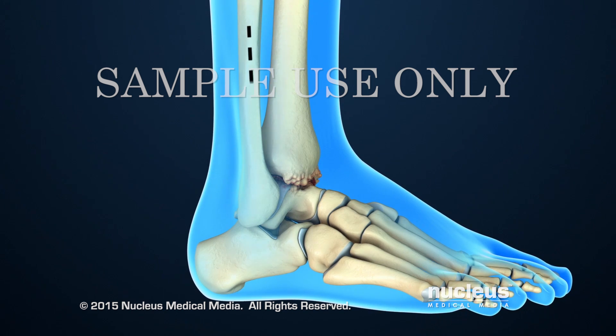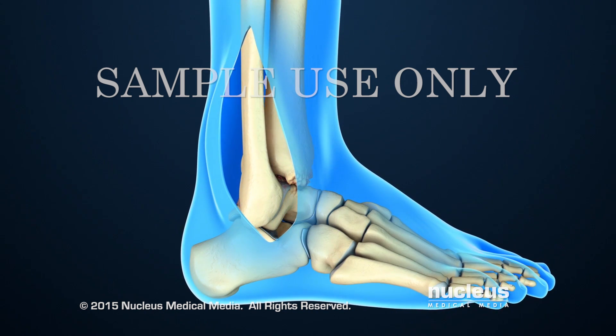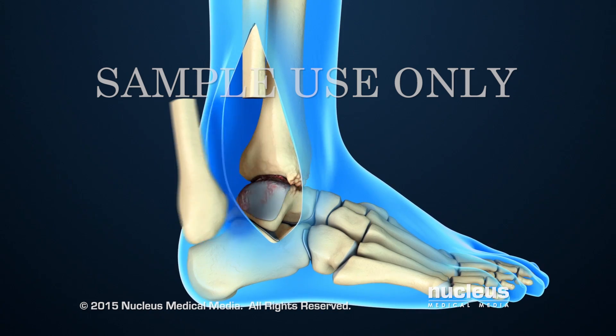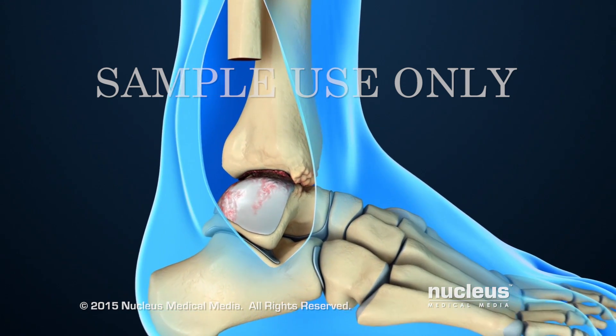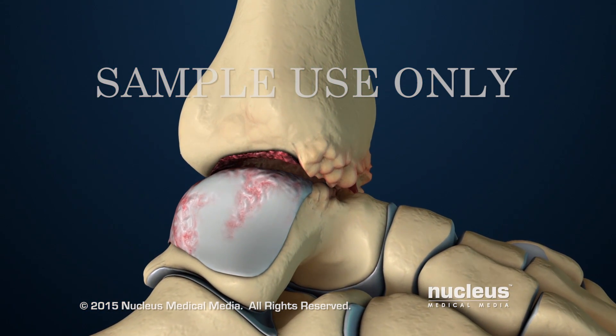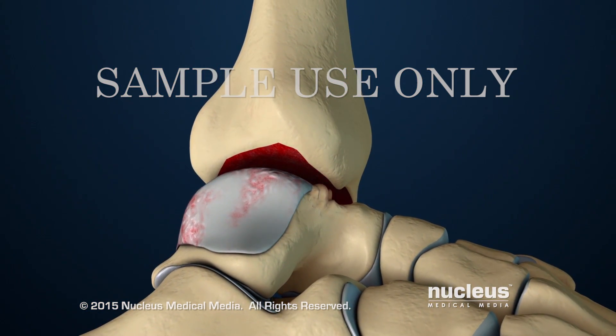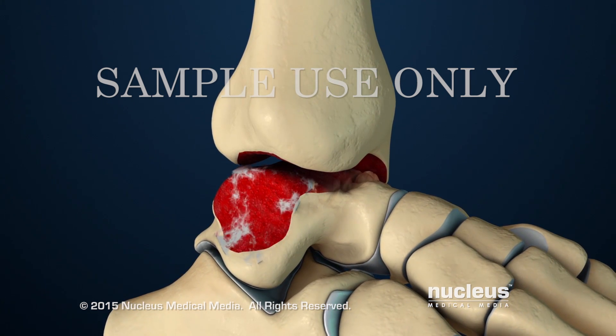The procedure will begin with an incision on the outer or lateral side of the ankle. Next, the surgeon will remove the bottom part of the fibula. This will allow the surgeon to see the tibia and talus bones of the ankle joint. Cartilage and damaged bone will be removed from the bottom surface of the tibia and the top surface of the talus.